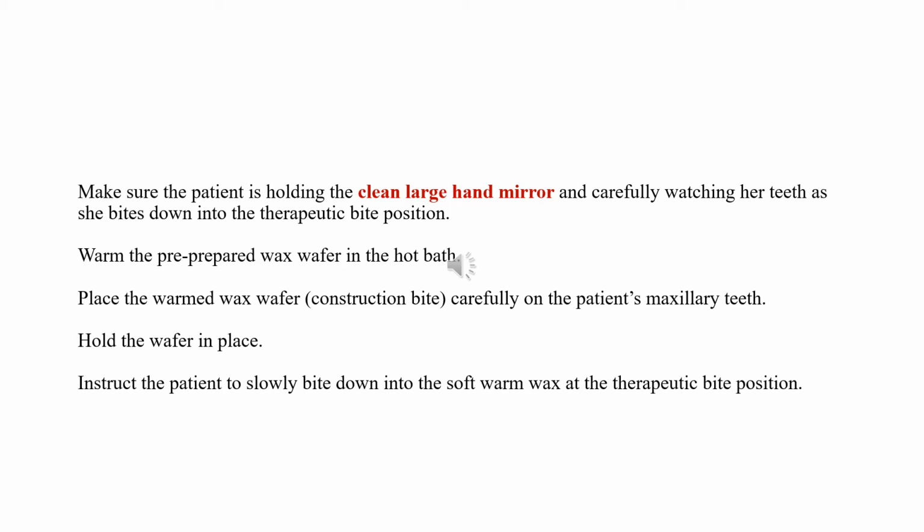This is the whole key. You're going to be saying, oh, no, no, stop. That's too far back. Go forward, go forward. Yes, yes, yes. And then go to the right. Yes, yes. Good. Now look in the mirror. Make those lines line up. Great. All right, now bite slowly. Stop, stop. Take your time. We're going to take your time.